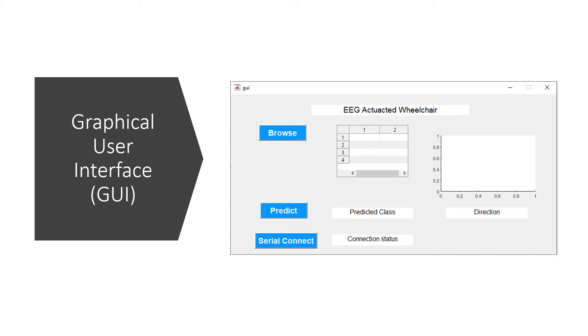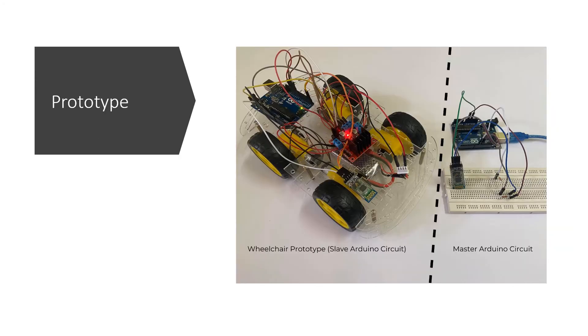The actuation performed by the wheelchair, which is the direction, will be illustrated in the axis in the GUI and the direction will be illustrated as well. This is the prototype created for the EEG actuator wheelchair. On the left is the prototype for the wheelchair and on the right is the master Arduino circuit which is used to communicate between the wheelchair and also the MATLAB.